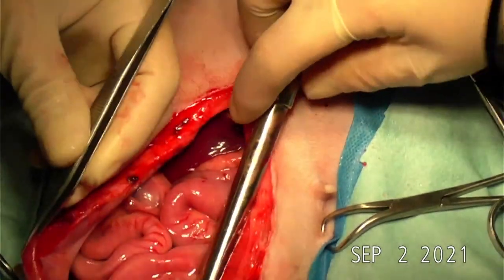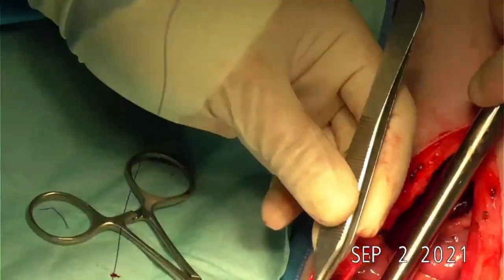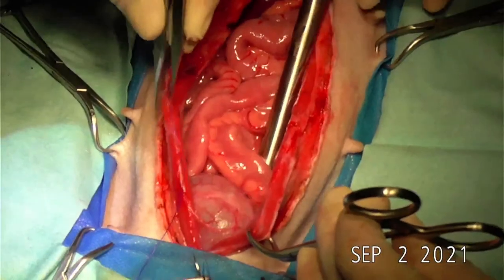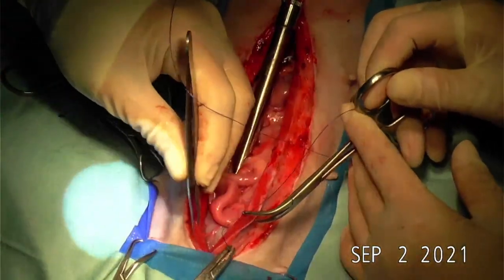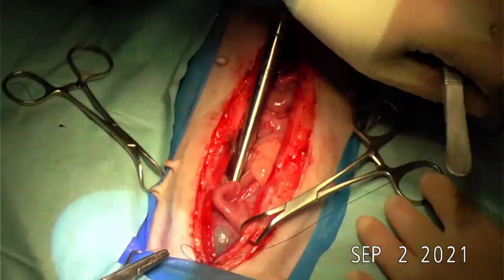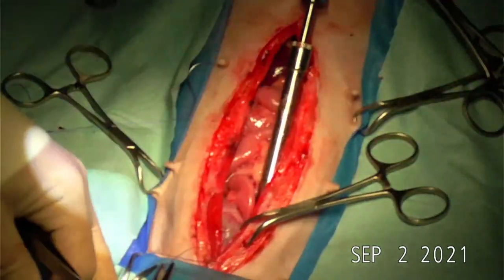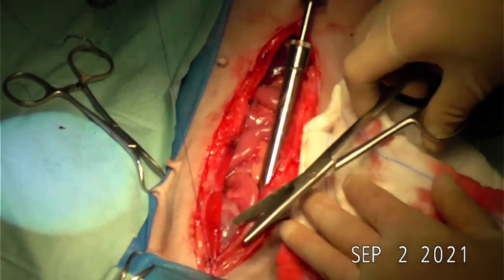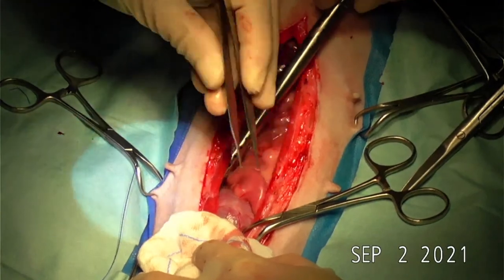Okay. Nagbukas ako ng 2-0. Maganda, CT2. Ang mga closure dito, CT2 or CT1. Nakita mo yung parayon niya, makapal. Yung isa, manipis. Okay, let's start here. So, meron sana tayong continuous na sana to. Kayanin kaya niya continuous? Okay, hanggang dito.